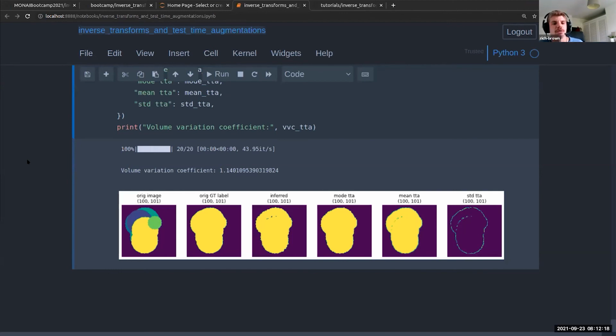So obviously in the training, you would be using more random data augmentations, but there's still transformations that would be applied at validation time and at test time. And it may be useful for you to do the inverse of those, particularly if you want to save those images to file. Yeah.